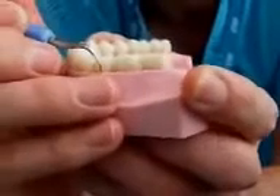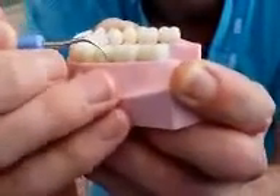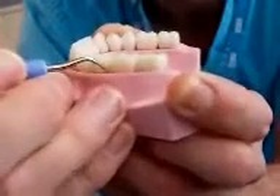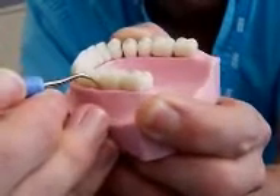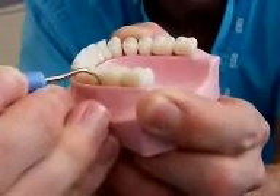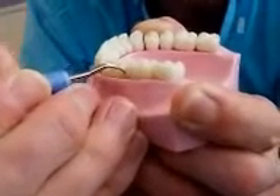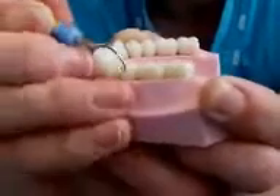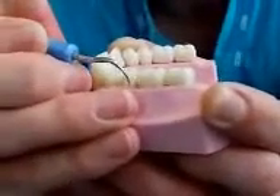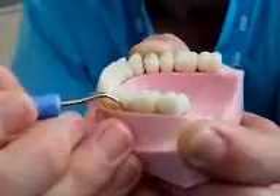So from the side here, that means coming around the tooth and then angling it round as much as is possible — and it gets difficult the further back you get. You come into the tooth space, into the proximal space, side-on. That's the sort of way you ought to be using it relative to the tooth surface.